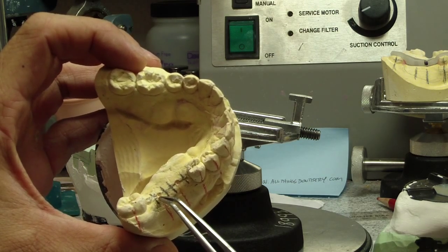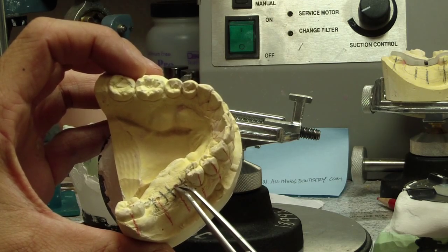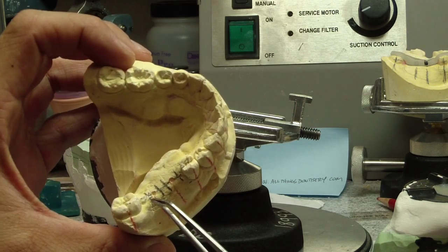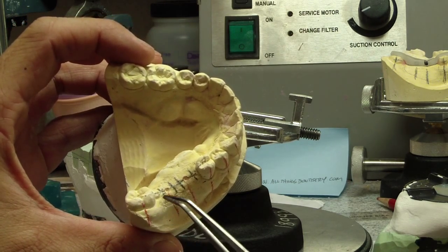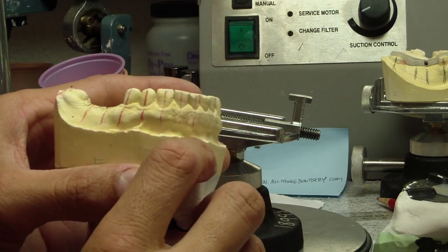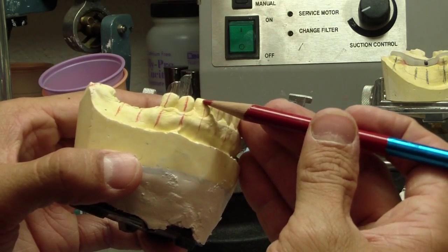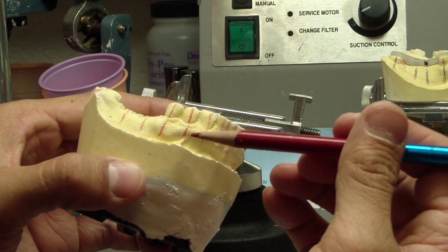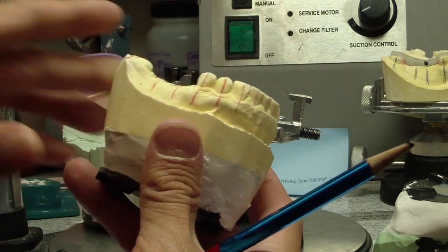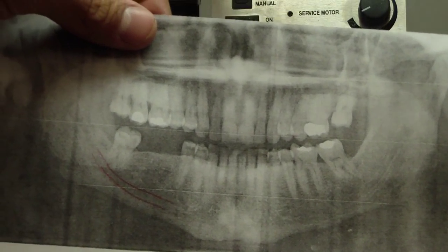So taking into consideration the big picture, what we want to do now is mark off the axial inclination of the adjacent teeth. It's only an estimate using our panoramic radiograph or our cone beam, but that will definitely help guide angulation.